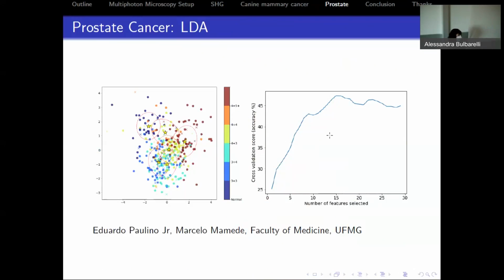When we do the cross-validation score accuracy with the imaging and software identification, we can get an accuracy of 45% as to match the pathologist diagnosis. And we had just 2 pathologist diagnoses. And so at the moment we are asking, how should we proceed? Because we have uncertainties in all the types of the diagnosis.